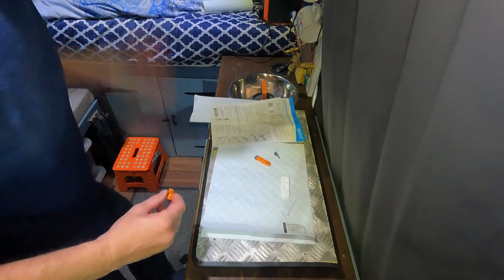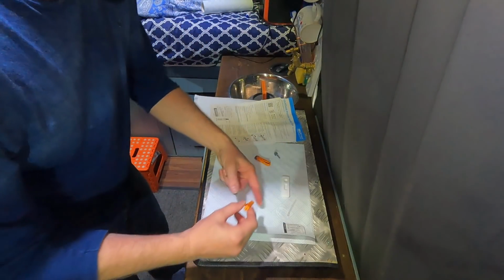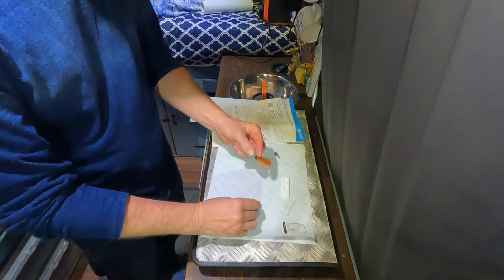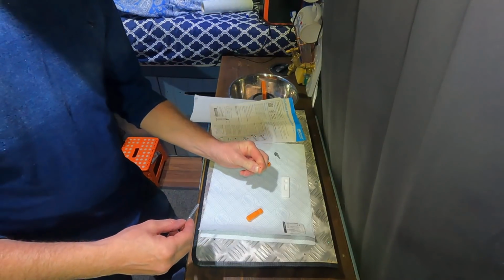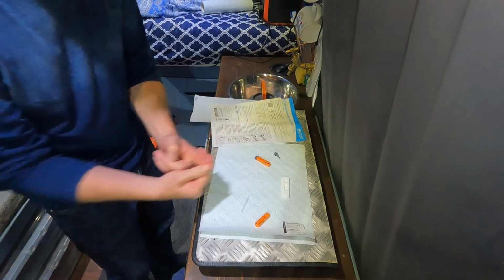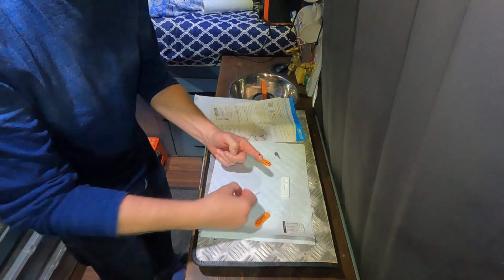Right, let's just get some blood in my hand. I'm just going to shake my finger down. Oh, I'm not looking forward to this. It says to press firm on the side of your finger and then pull the trigger. And then squeeze said finger until you get a good drop of blood. That don't look very good to me. Alright, let's just massage that out a bit more. Let's hold it down below my waist. There you go. Oh yeah, that looks like plenty.